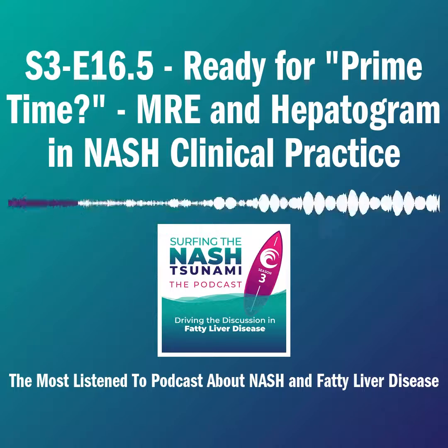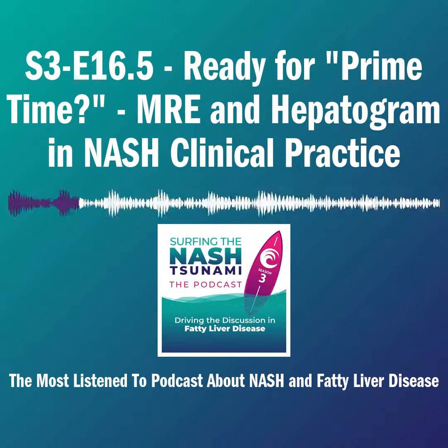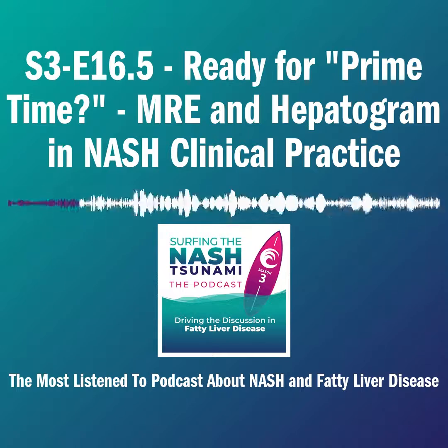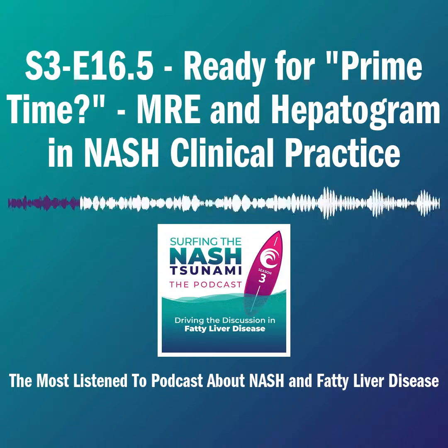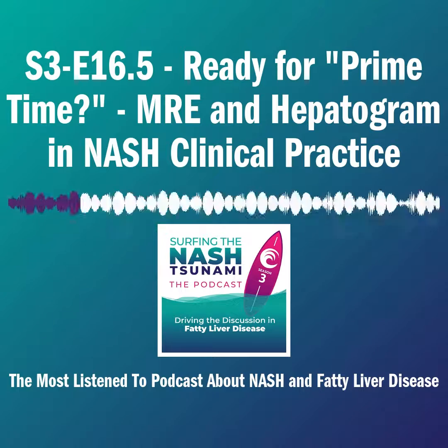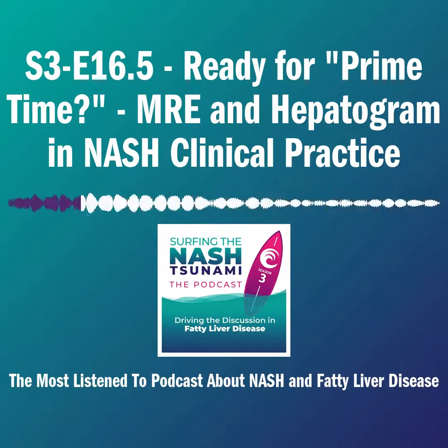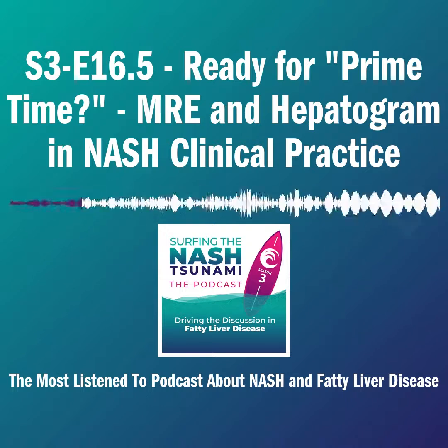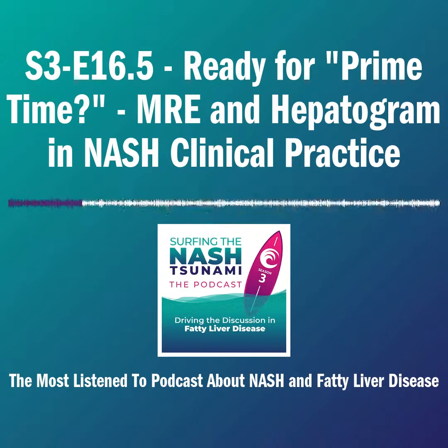It has been years now, and the insurance covered it. And I have had a large cohort of MRE patients as I thought it would be approved by insurance. And I did it the same way I'll do it myself. I went and checked myself with PDFF and MRE if I have fatty liver or not. I used it as sequential testing as well after transient elastography. And sometimes I used it as a first tool when I felt the patient would benefit from it immediately, rather than just going through other NITs, such as BMI of 40 or so.